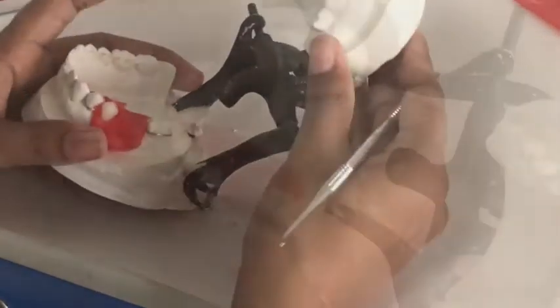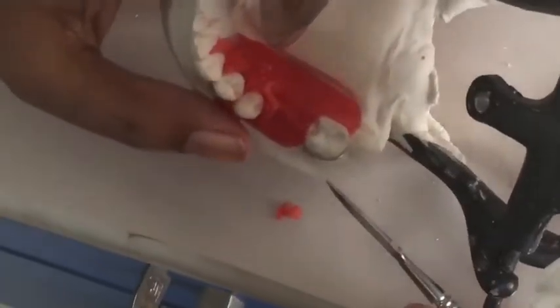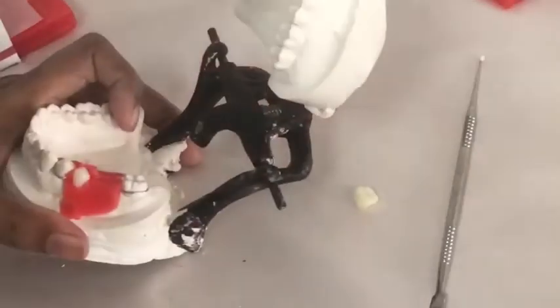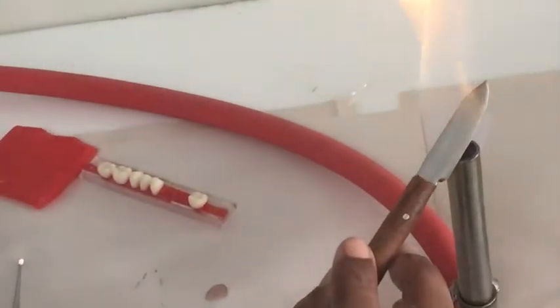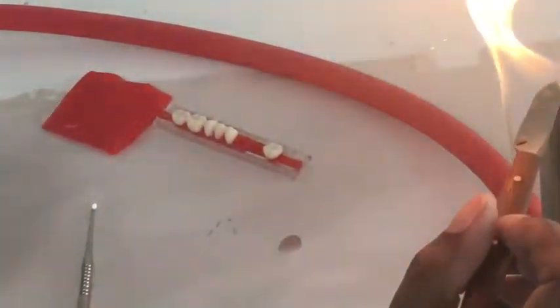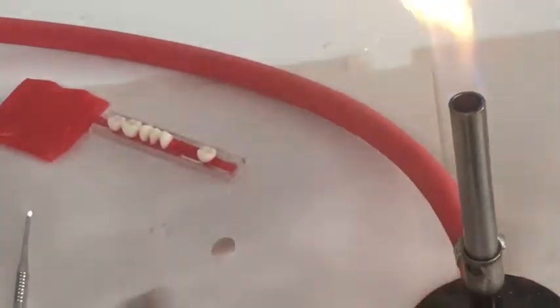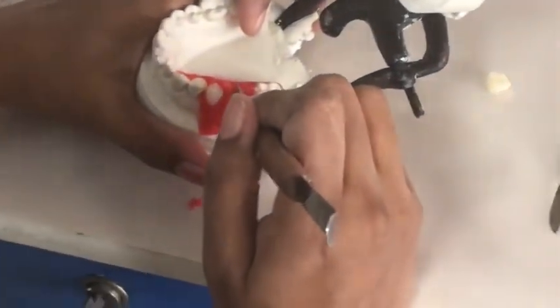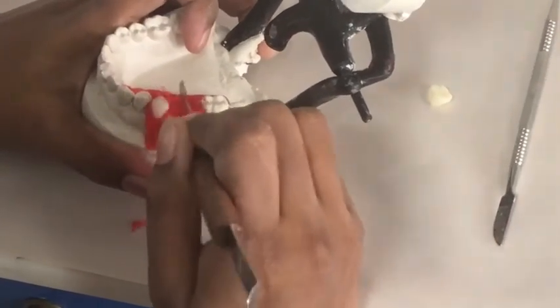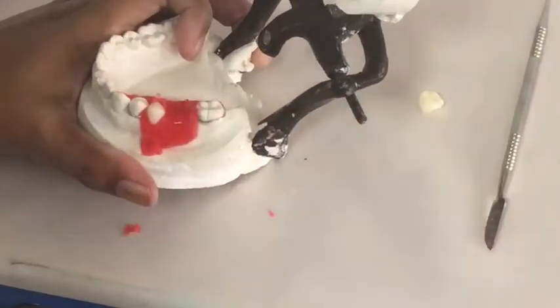The mesiobuccal cusp tip of the mandibular first molar should engage the embrasure between the maxillary second premolar and first molar, and the mesiobuccal cusp tip of the maxillary first molar should fall in the buccal groove of the mandibular first molar. Now this may seem technically complicated, but if you place your teeth properly along the center of the ridge, they will align automatically in the ideal occlusion with the opposing arch.